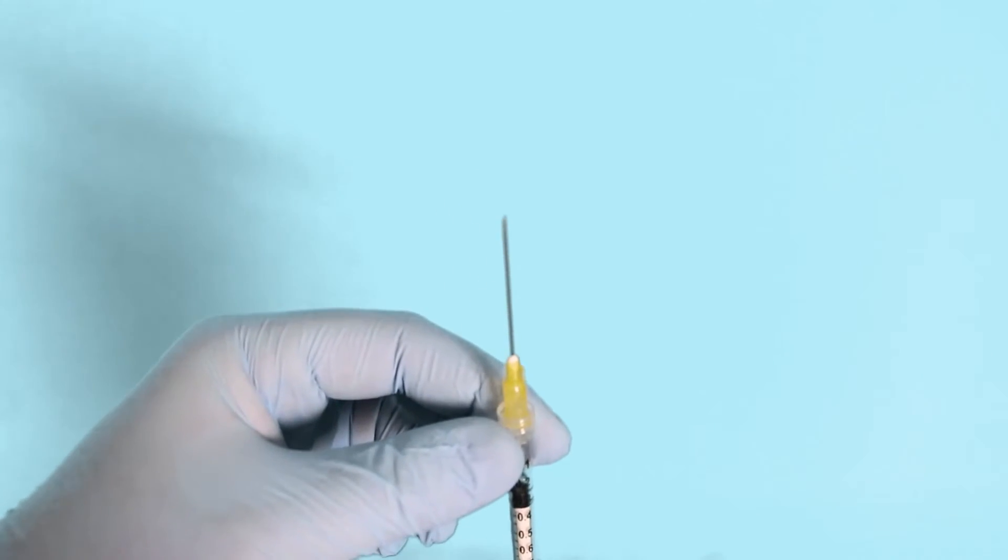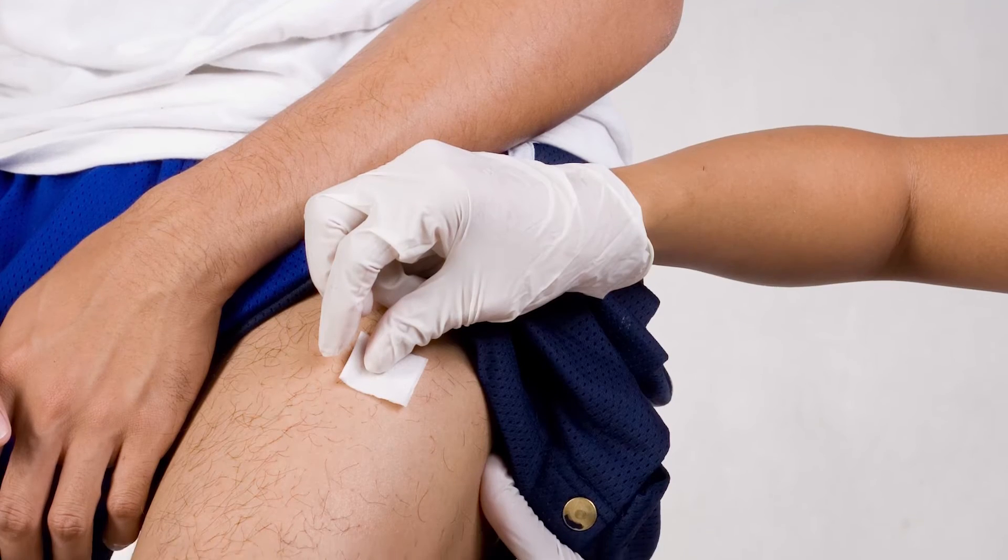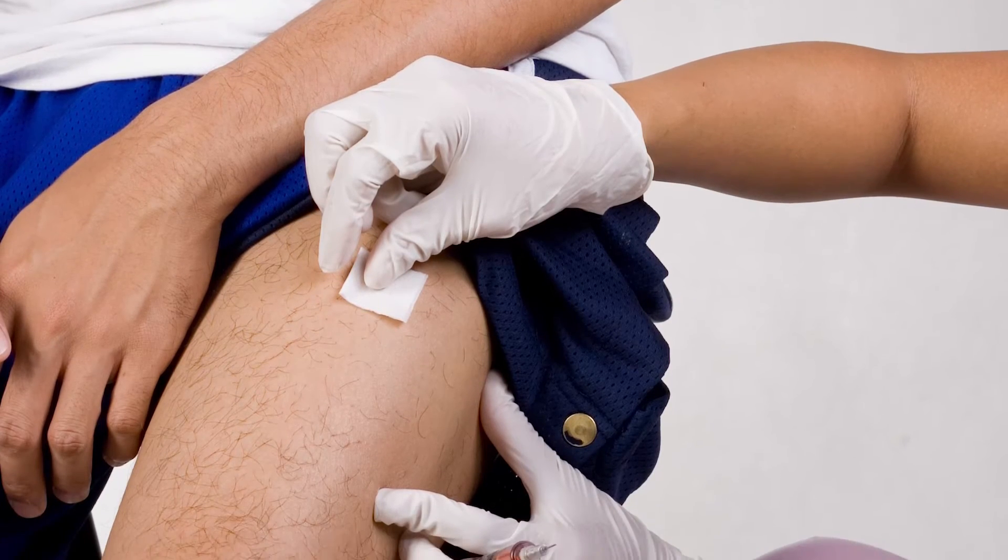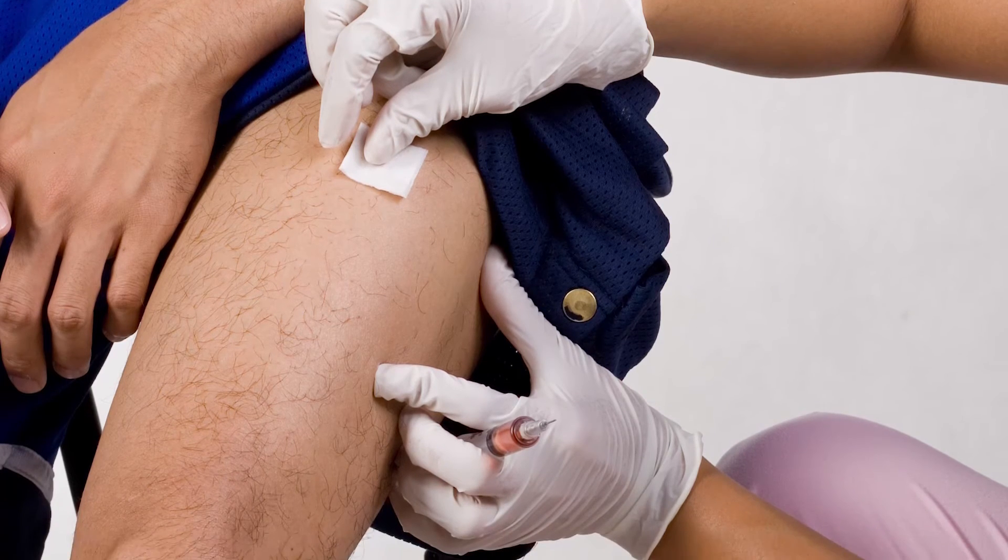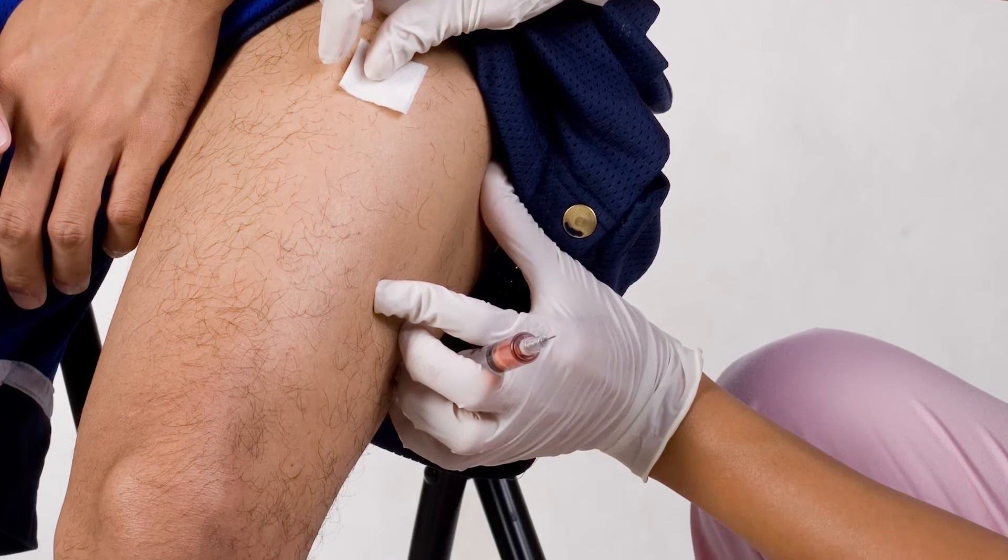The appropriate injection route for epinephrine 1-1000 is intramuscularly or subcutaneously into the anterolateral aspect of the thigh, which is midway down the side of the thigh.